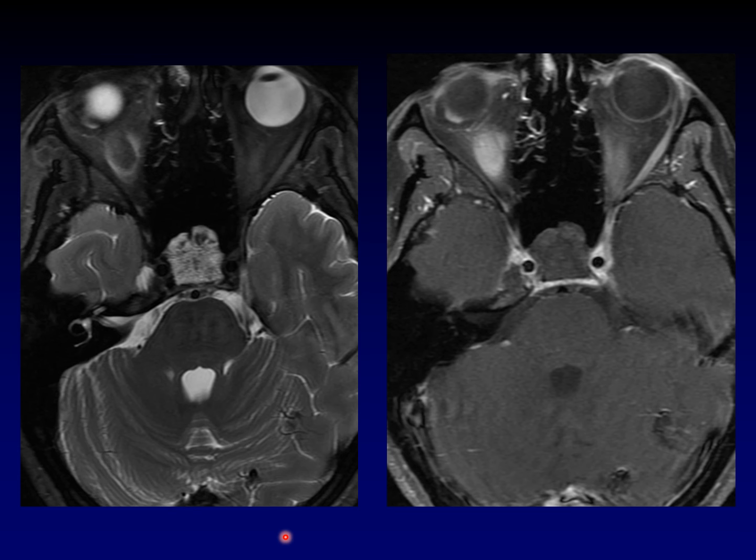This works the other way too. Look at this nasty looking clival lesion. Of course, we're going to call this a chordoma, this heterogeneously enhancing lesion in the center of the clivus. So we advised resection. When it came back, the path said ecchordosis. You just can't win here. You have to call these things benign appearing notochordal remnants. I'm not even sure I would have called this one benign appearing. Would have just gone and called it a chordoma.